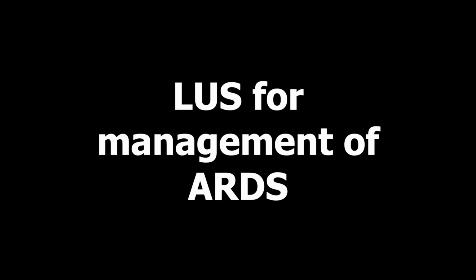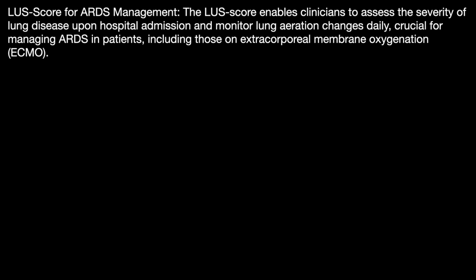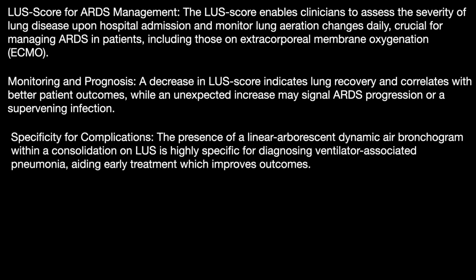Finally, how lung ultrasound will help us in the management of the patient. Lung ultrasound score for ARDS enables clinicians to assess the severity of the lung disease upon admission to the hospital. Monitoring this lung aeration daily is crucial for managing ARDS patients, including those who are on ECMO support. A decrease in the score indicates lung recovery and correlates with better patient outcomes, while an unexpected increase can signal ARDS progression or a supervening infection.